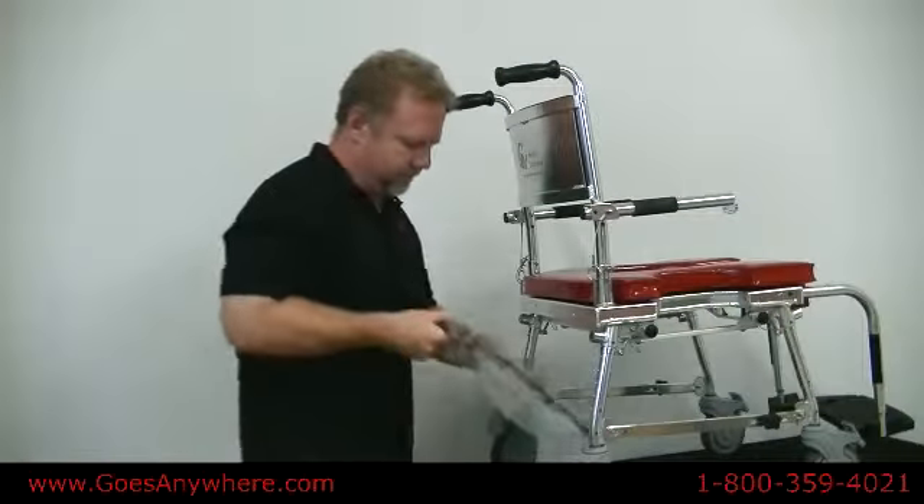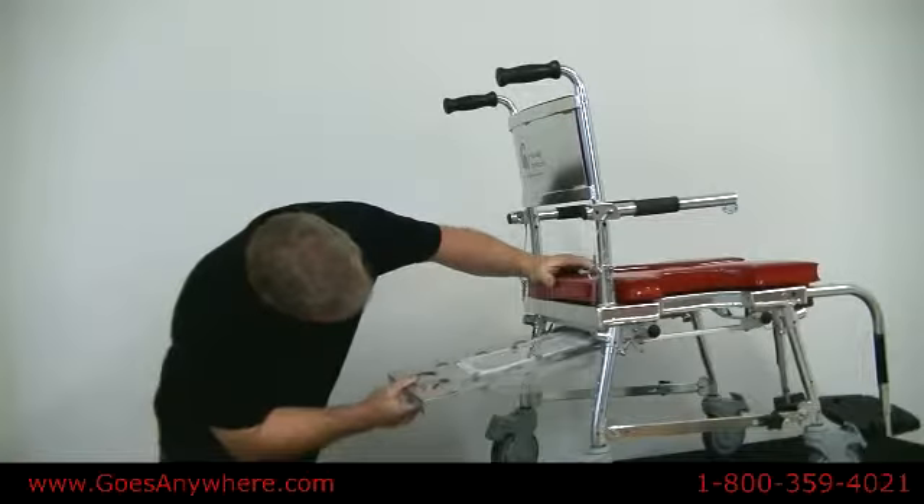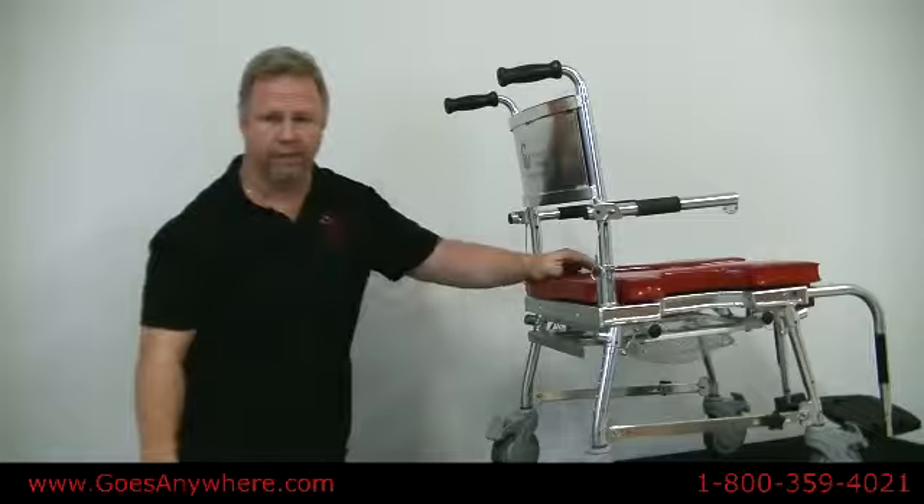Once you have your rails installed, you can place your commode tray in. Just slide it into the two grooves underneath, slide it on, and away you go.